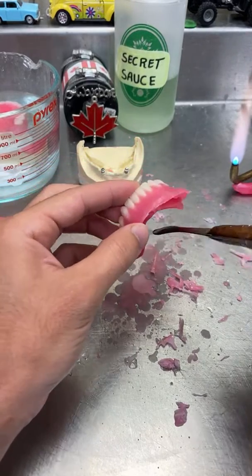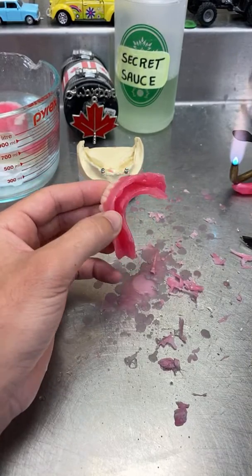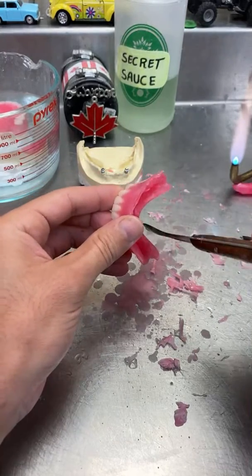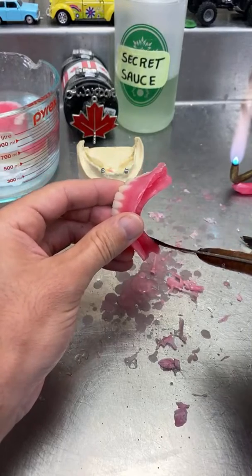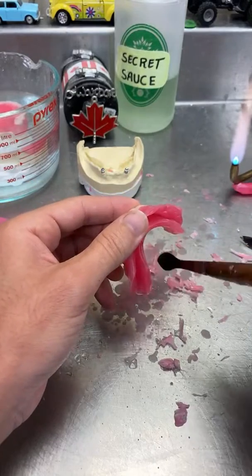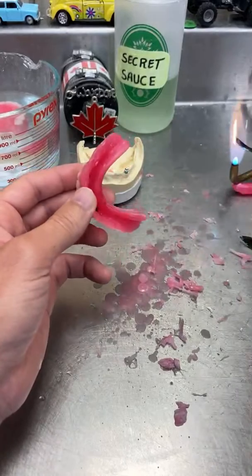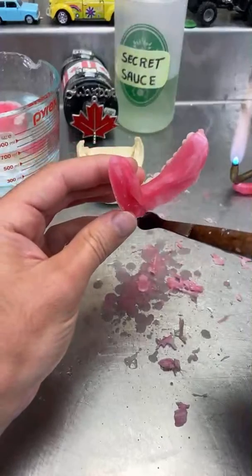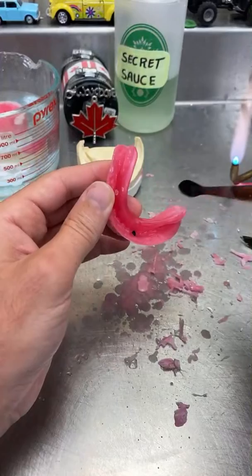So those implants are called analogs, and they are actually attached to the lower when you're pouring the impression. So you take the impression in the patient's mouth, you put those analogs in the impression, and then you pour the impression and it will come out with it. They are not the same ones that are in the patient's mouth, but very similar.